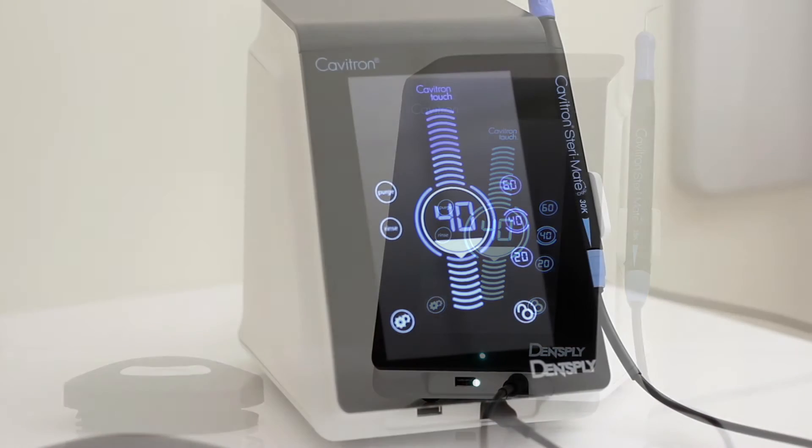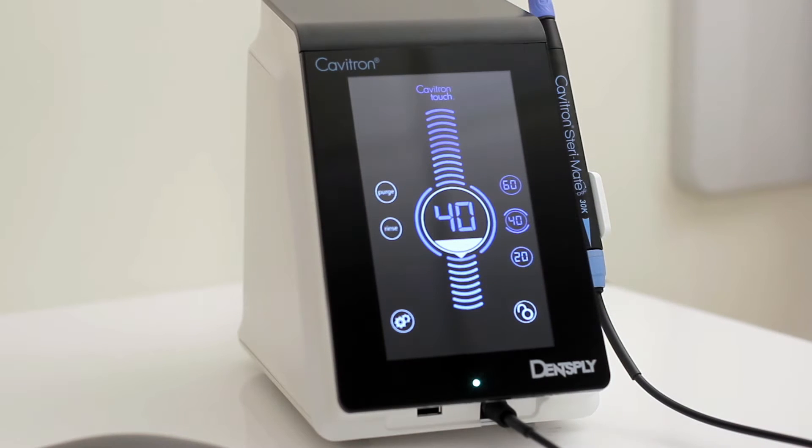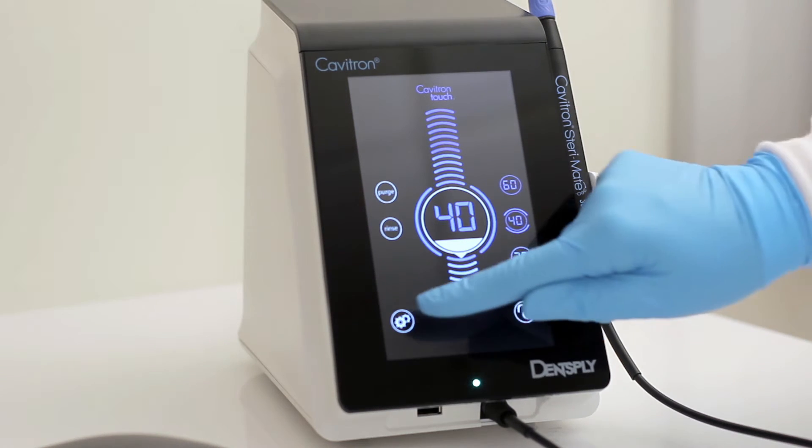The settings icon accesses the menu allowing for syncing of the foot pedal to the unit, brightness setting, and the tap-on foot pedal control setting. To access the settings menu, press and hold the icon for 2 seconds.